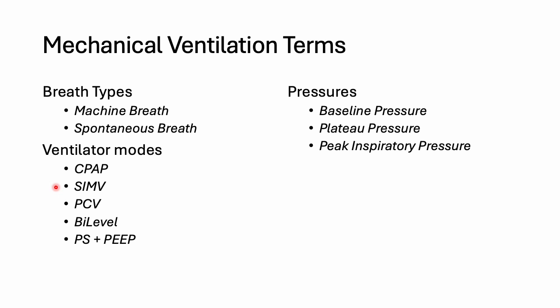But because mechanical ventilators are made by different companies, they like to patent some terms, and on different machines the same mechanical ventilation term might be named differently. I'll discuss all these later, but don't worry about manufacturers' proprietary terms. Generic terms, understanding the principles and the concepts, are more important. Then we will talk about the pressures in the next 2 slides, pressures that you need to understand in order to understand mechanical ventilation.